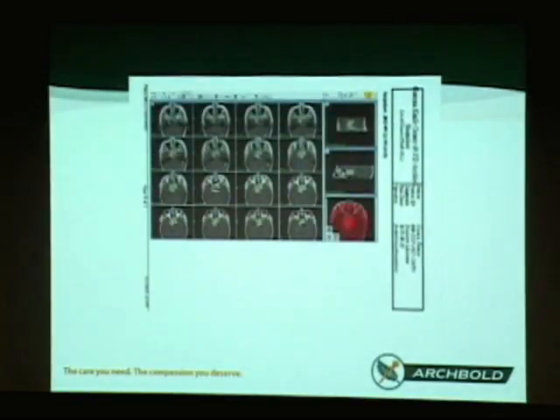That was just a pituitary tumor. Just to show you how accurate some of these have to be. This is a pituitary tumor, and the optic nerve goes right over the tumor, if I could show you in 3 dimensions. And so we're able to treat that tumor and not affect the optic nerves. I don't think we've had a single optic nerve affected yet. We had one with a tumor smushed right around it, and the lady has one field cut, but that's it. And she's about 8 years out. I just saw her yesterday, so that's a wonderful thing to be able to do.